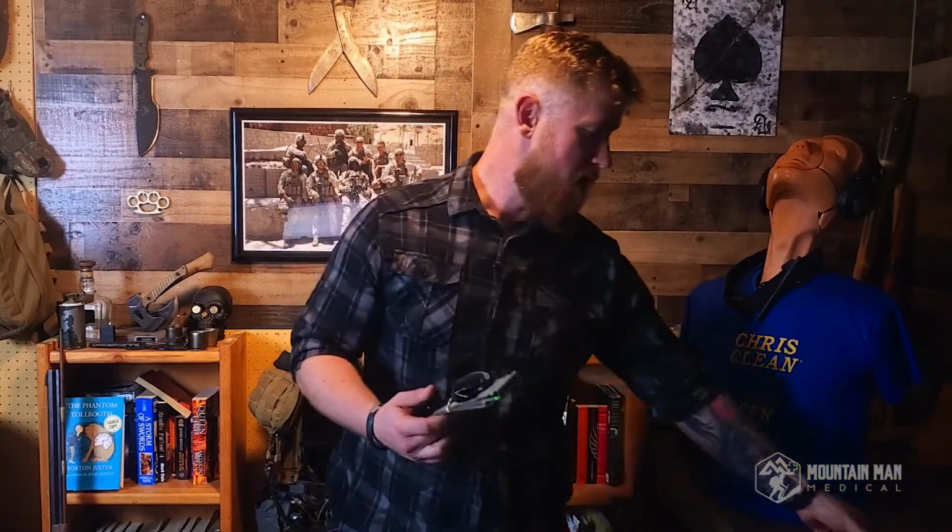Now, the first con is that it's bigger than either the CAT or the SOF-T Wide. I've got the CAT tourniquet here, and side by side you can see it's taller, and of course, like we already said, the strap is wider. And the SOF-T Wide, we can also see it's substantially taller, although the REV MedX tourniquet is thinner than the SOF-T Wide or the CAT tourniquet. So there is that. You could potentially stack these on top of each other a little bit better, especially if you had two and you put them back to back.